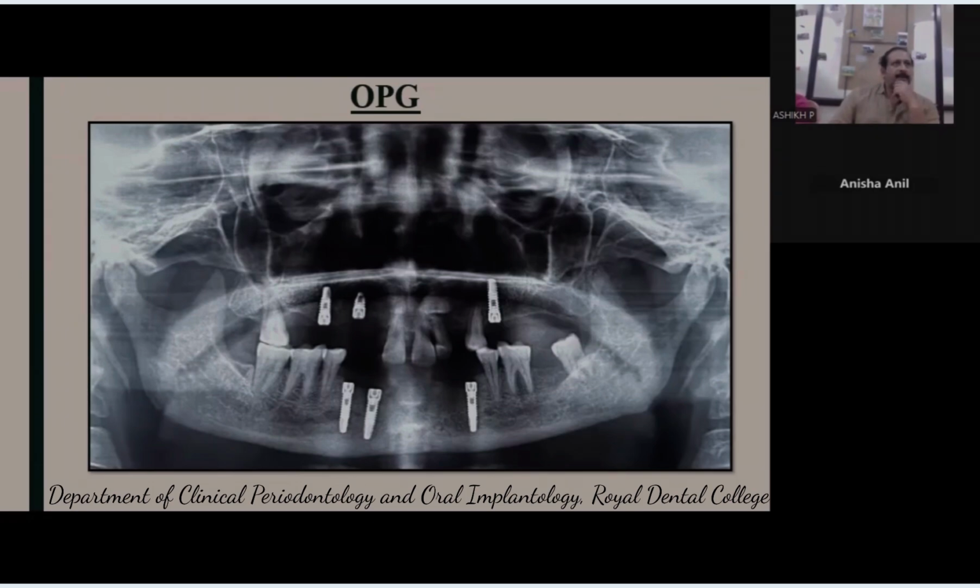Somewhere in between 6 and 7. So you can cover up till 6 in that region. So you want to have the same harmony on this side as well. So it should be somewhere at the terminal end of 6. So that you can have some amount of occlusal contact for that 4-7 region as well. Am I right? Okay, so that should be planned because implant should be always planned in such a way that the terminal ends should have an implant.